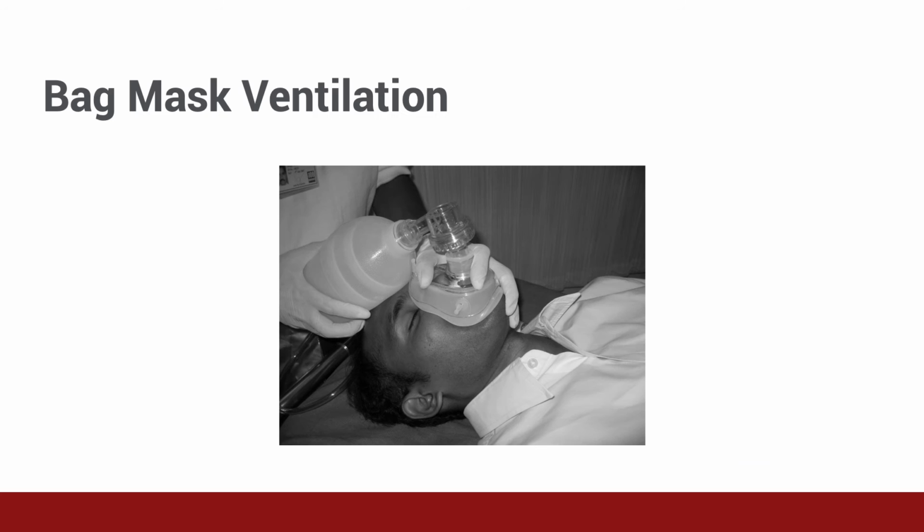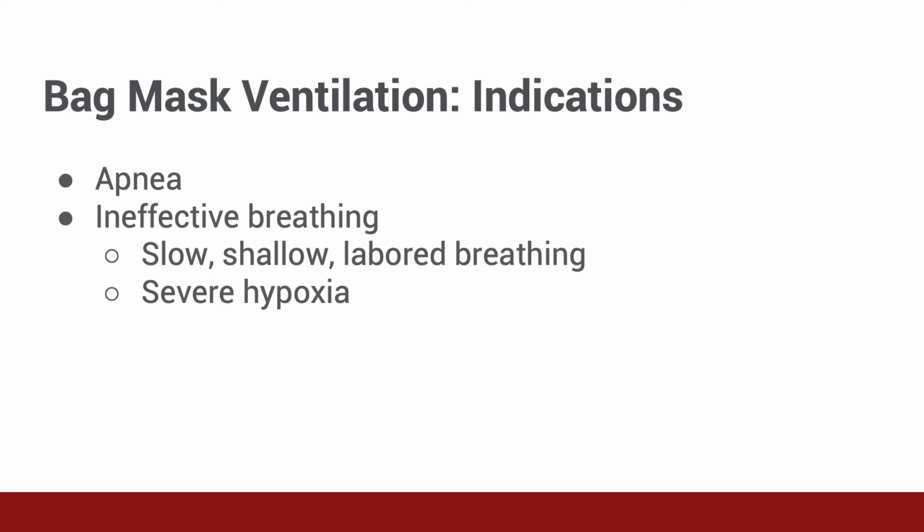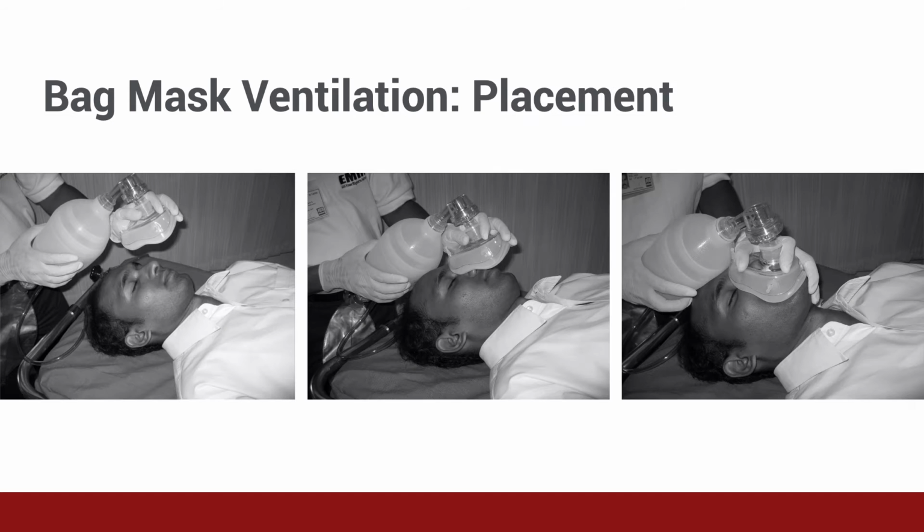Now that we're familiar with airway adjunct placement, let's discuss bag mask ventilation. Dr. Newberry, can you remind us when bag mask ventilation is indicated? First, if a patient is apneic or not breathing at all, they require bag mask ventilation to provide temporary oxygenation and ventilation. Second, if a patient is breathing, but their breathing is not effective to provide the oxygenation and ventilation they require, bag mask ventilation can help augment their efforts.